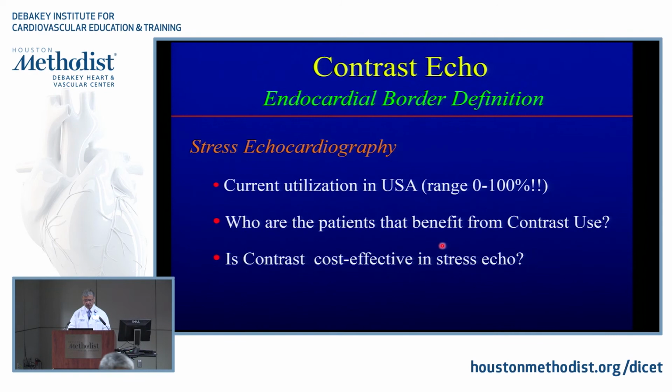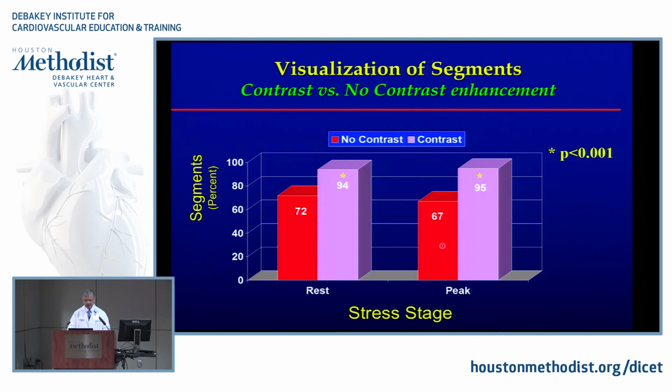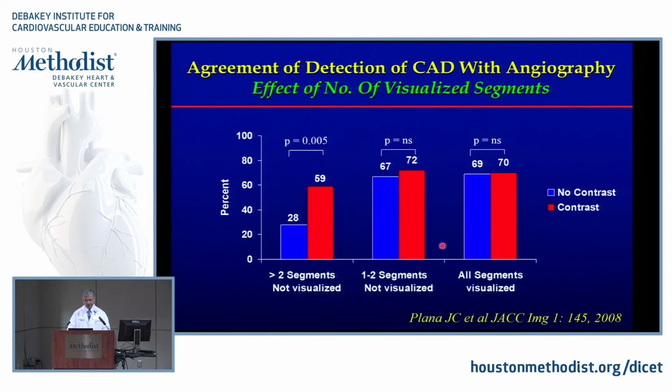And we did a study, you probably know that, Juan Carlos Plana, when he was a fellow here a few years ago. It's like, my goodness, almost 9 years now published. Did a study that I know will not duplicate again. Two dobutamine stress echoes, randomized, one with contrast and one without. And bottom line is you could see better, no question about it, at rest and during stress. And if you have more than two segments that you don't see, your accuracy of interpretation compared to cardiac catheterization goes down significantly. So, and I'll show you a case right here, a case in hand.